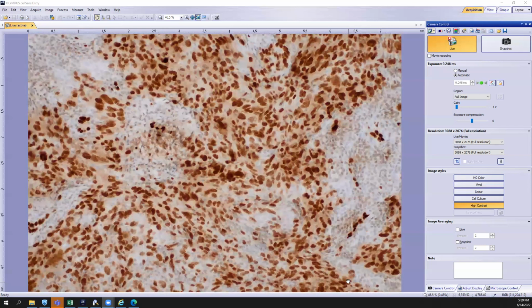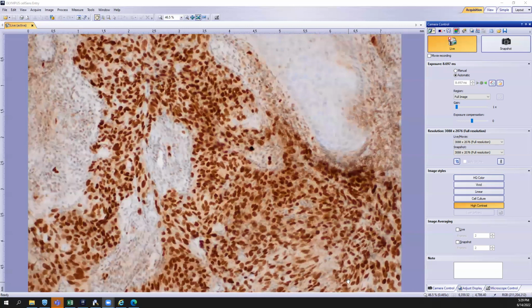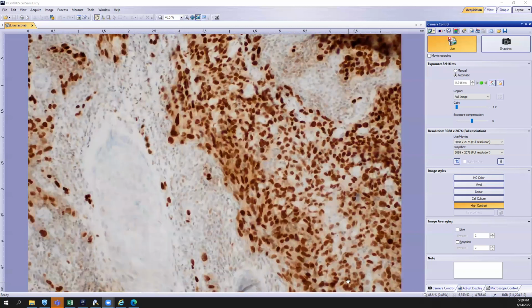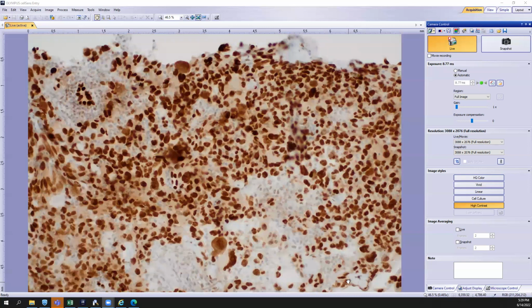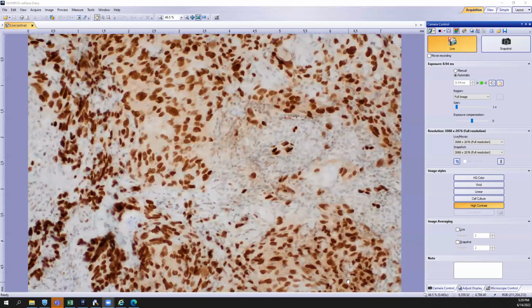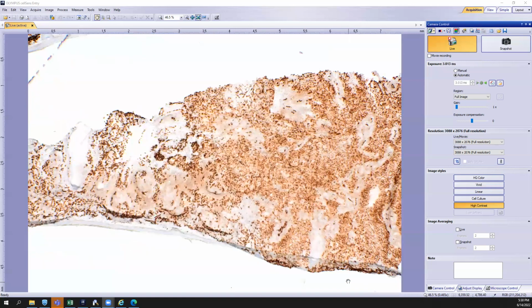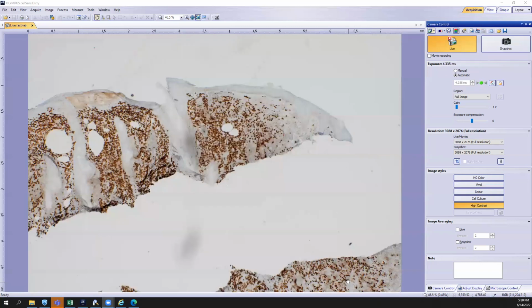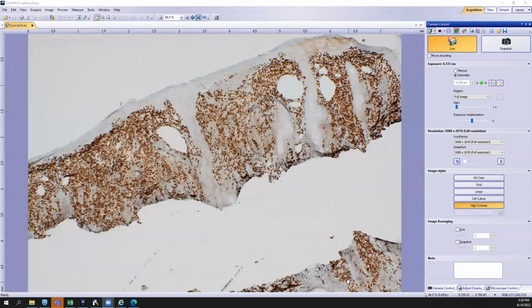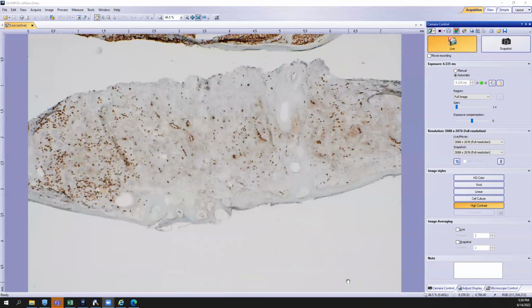So it just goes to show you that angiosarcomas can be so proliferative, it's hard to immediately tell what it is. So in this case, it's covering pretty much the entire biopsy specimen here. And just to show you, pretty much every section is positive for ERG diffusely. Maybe not as much here where you were getting a little bit more inflammation.